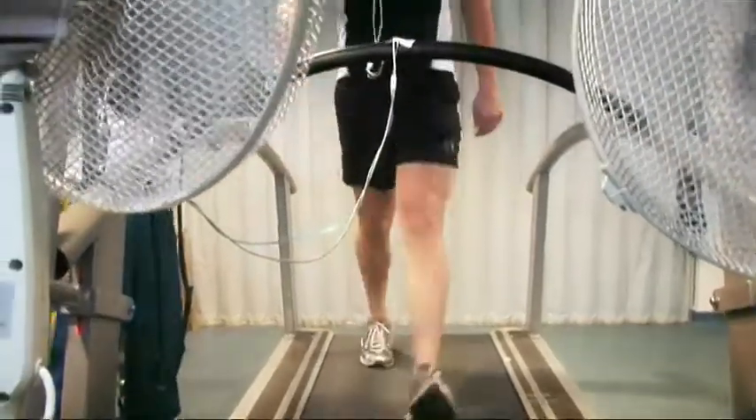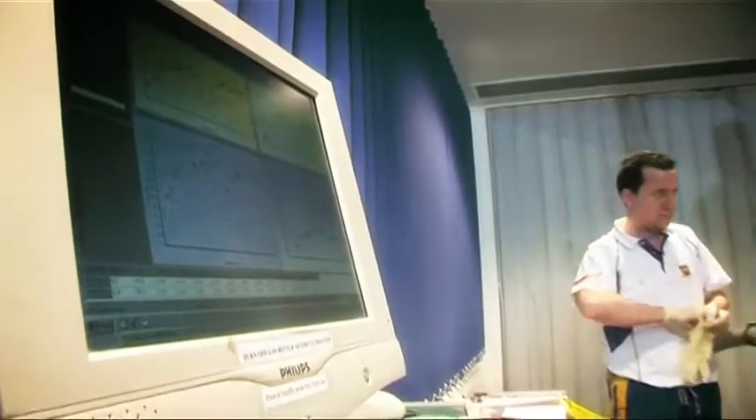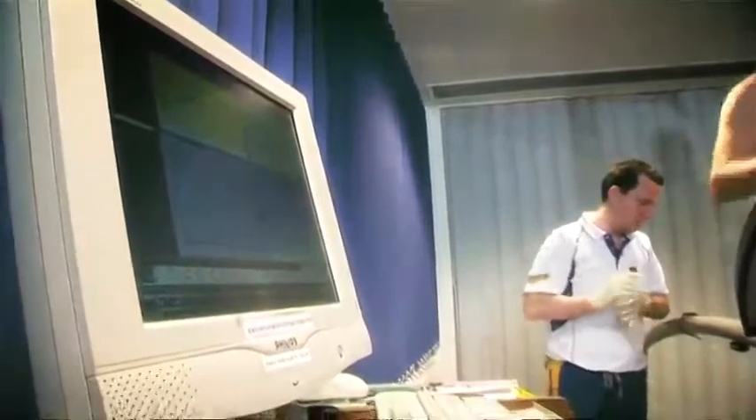What it involves is the subject running on the treadmill, and we record all the oxygen that they use. We also measure some of their blood parameters whilst they're running, and from that we can look at how aerobically fit they are.